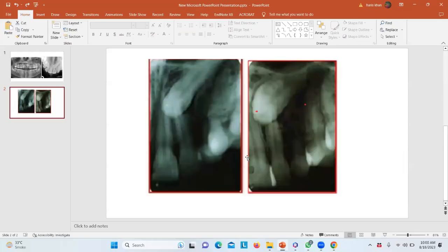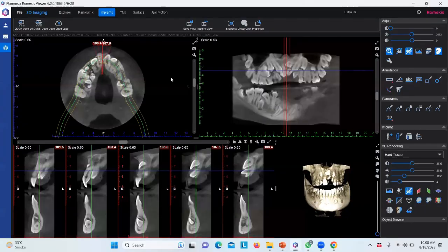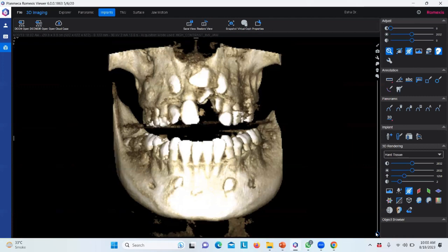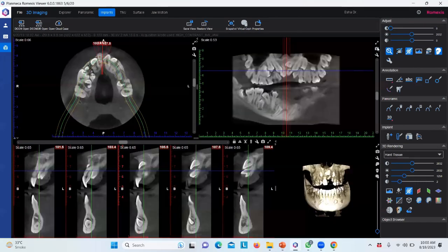Now for CBCTs. In exams, they typically show cross cuts and ask about root resorption. While people can locate canines in CBCT easily, root resorption interpretation on cross cuts is more difficult. In the May 2023 exam, one station showed a cross cut and asked in which position the canine was causing root resorption.